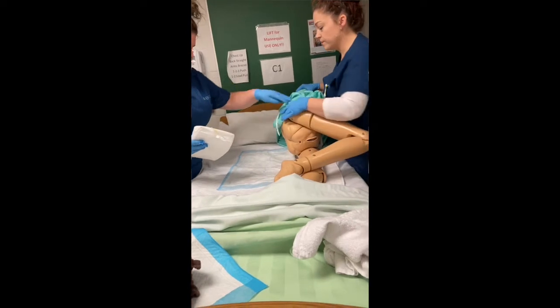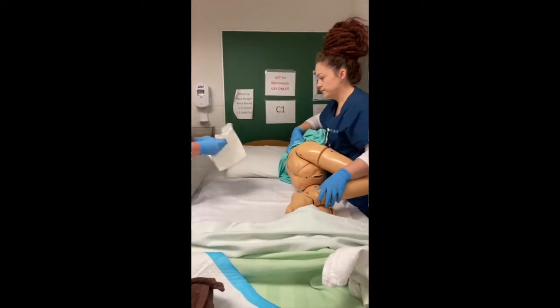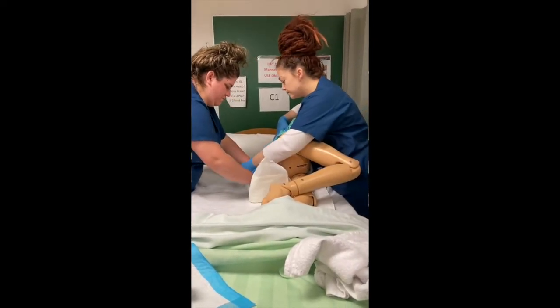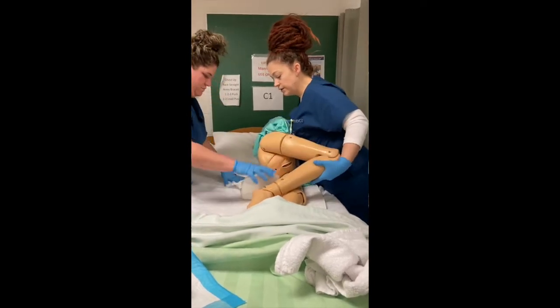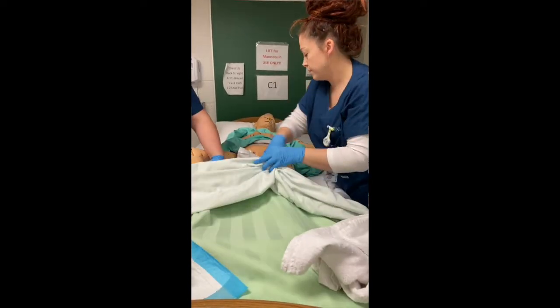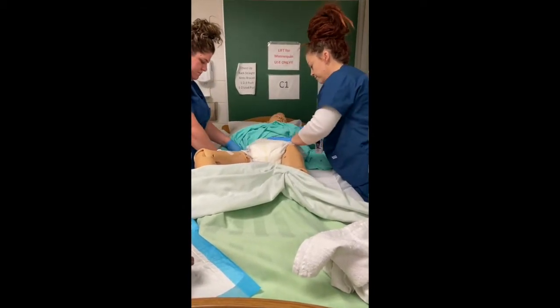We then work together to mobilize the patient to Sims position so that we can remove the soiled blue soaker pad and place a clean brief under the patient. We restore the patient to supine position to finish fastening the brief, making sure that the legs and waist are fitting properly.